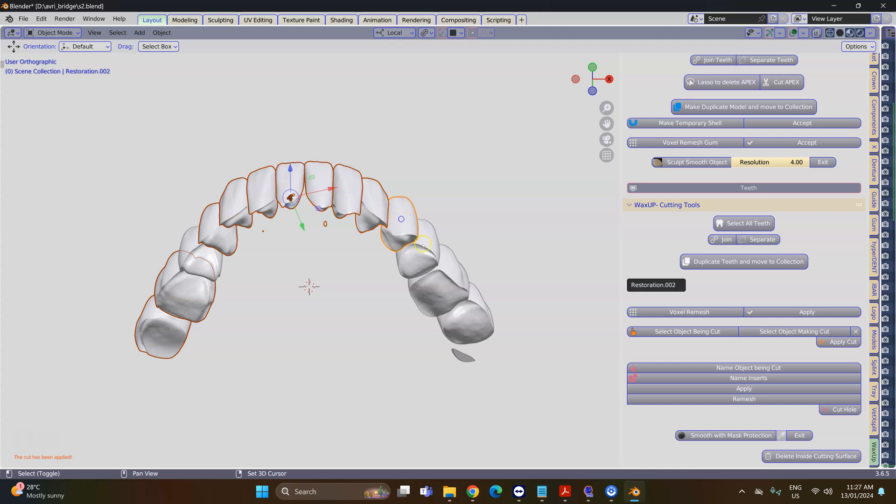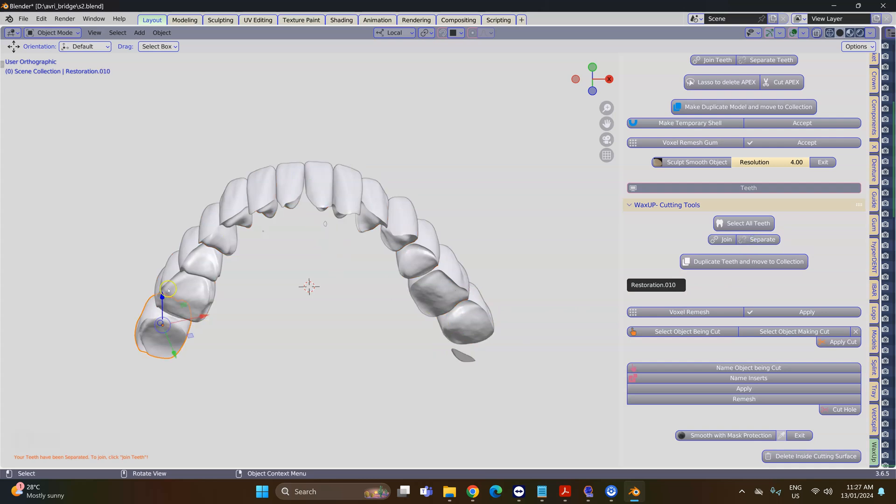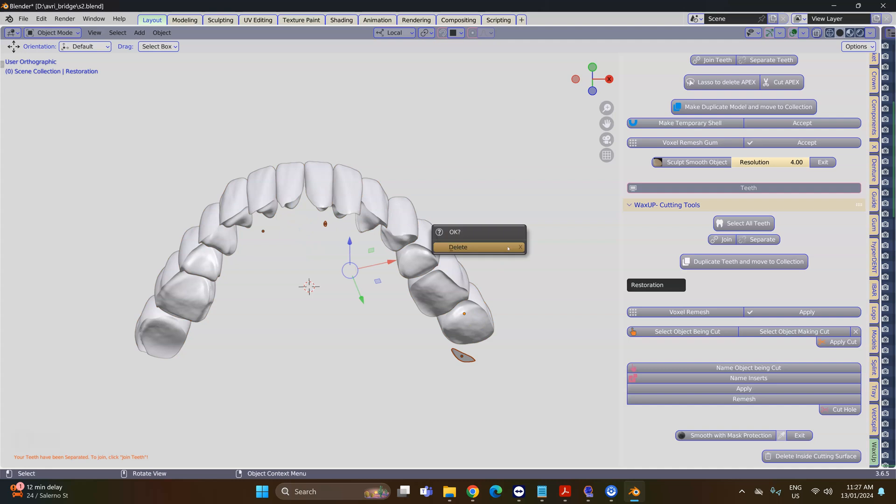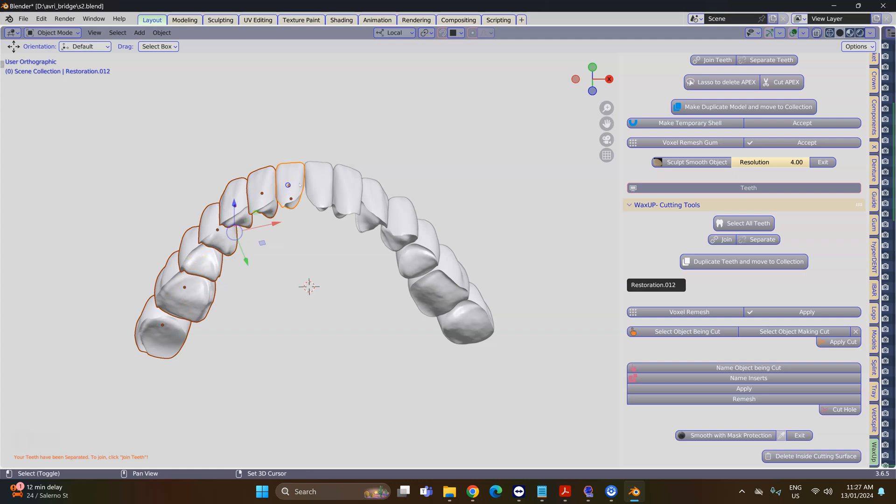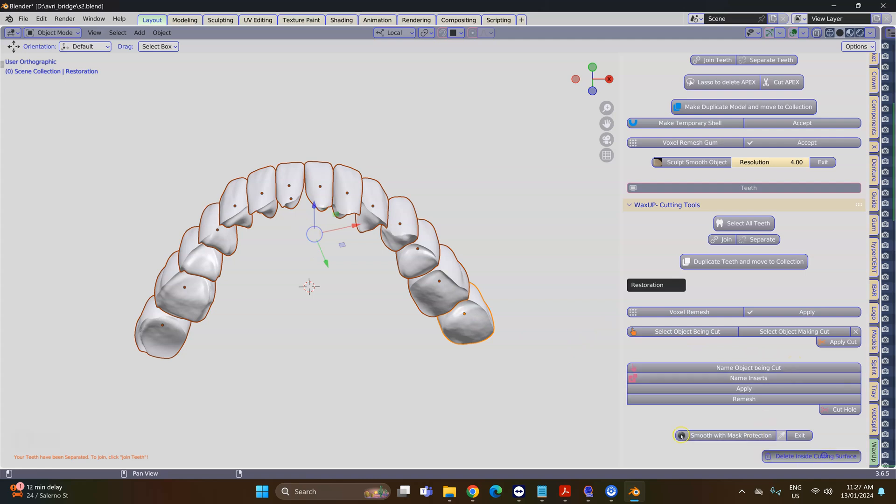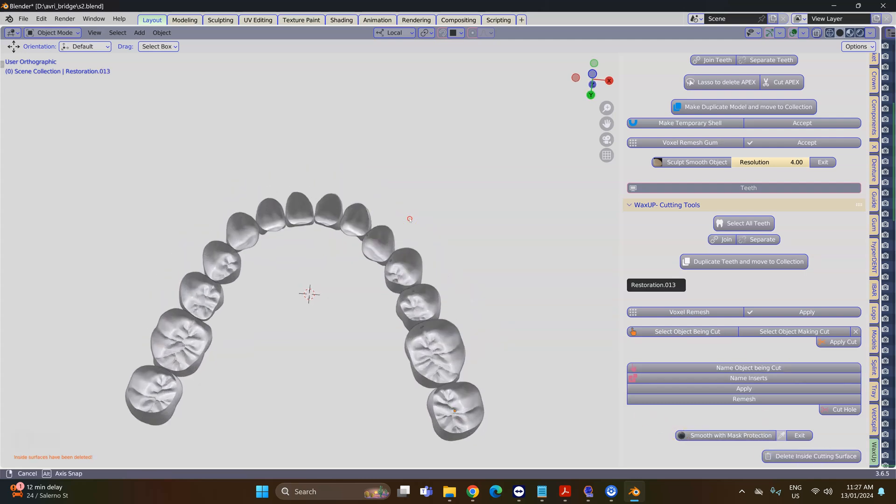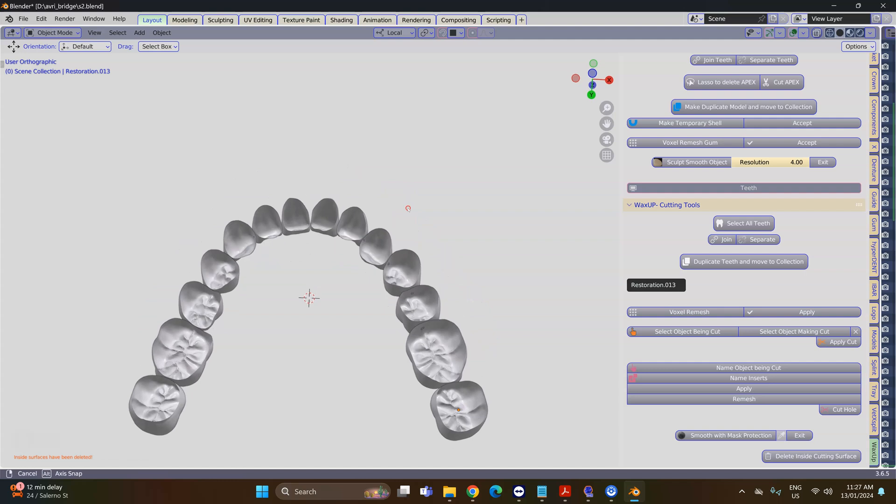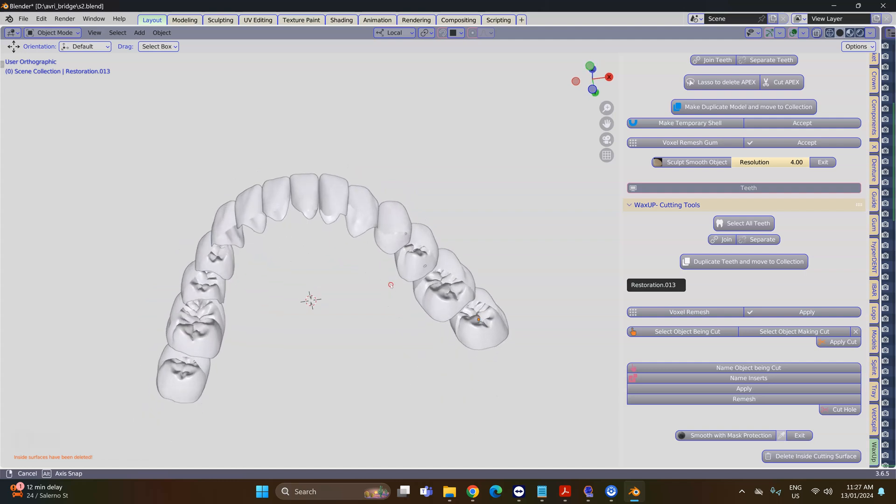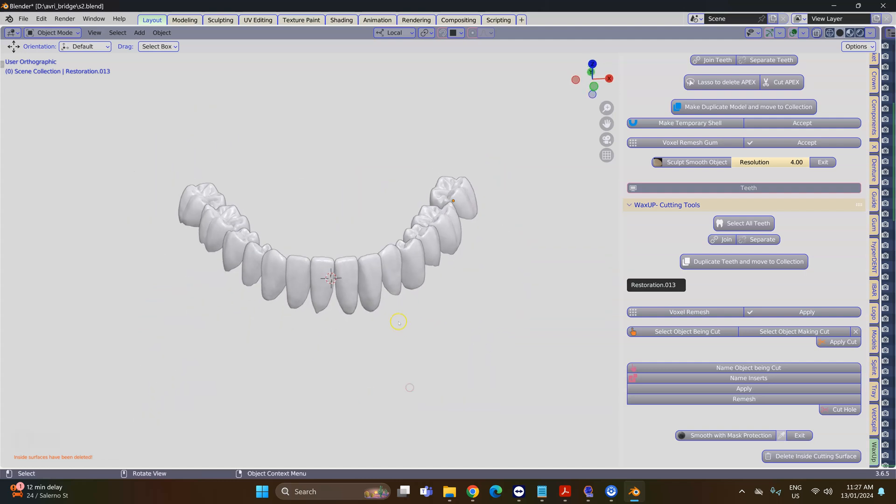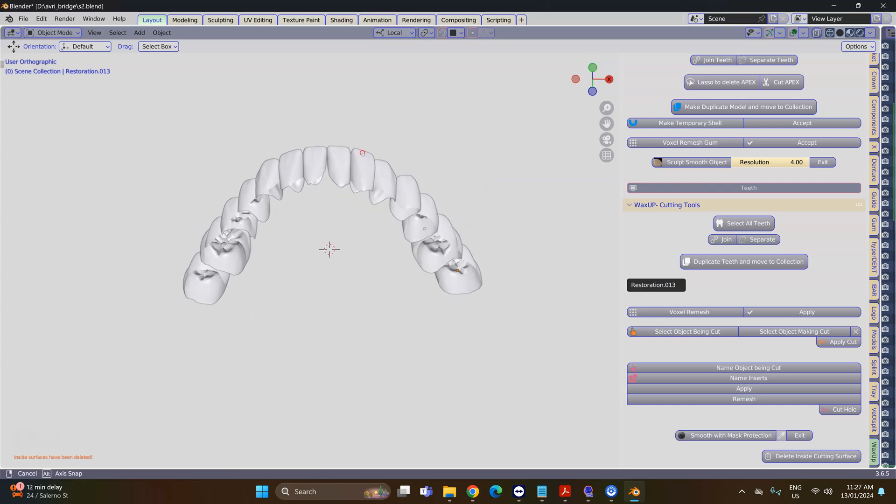I'm going to select all of these and separate them. Then I'm going to select all of them and use Ctrl+I, which selects the inverse, and X delete. That will get rid of all the other bits and pieces. Again by selecting all of them, we're going to clear away the fitting surface. So delete inside cutting surface.